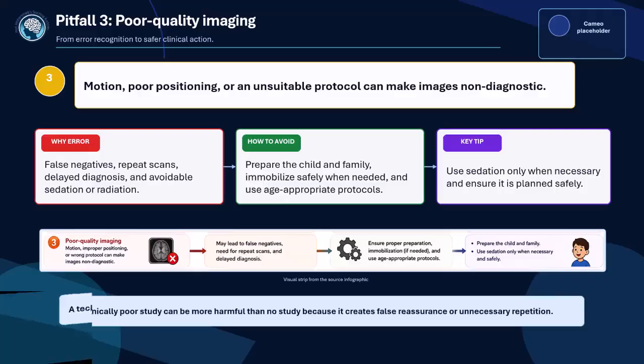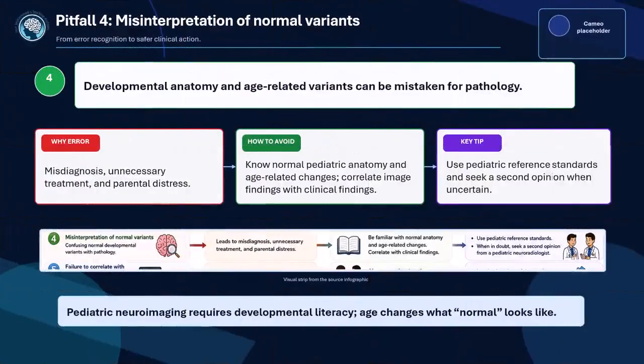Next slide, please. A frequent challenge in pediatric neuroimaging is misinterpreting normal developmental variants as pathology.